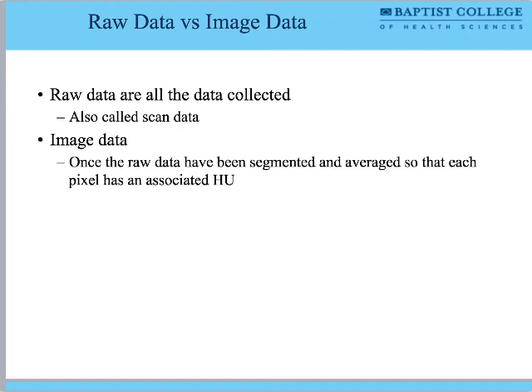I can't look at that and see anything. I can't look at a tornado and guide any kind of patient care. So we had to figure out a way to take that tornado of information, that raw data, and create an image out of it. That's where the math was important.